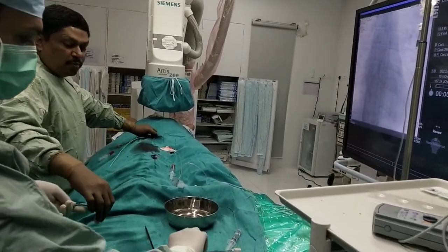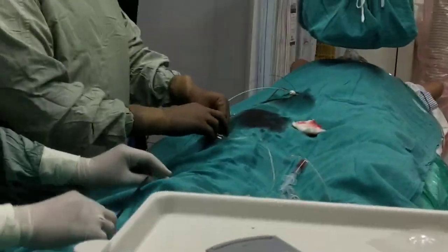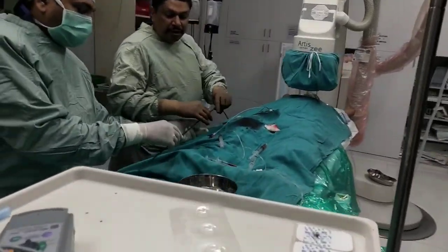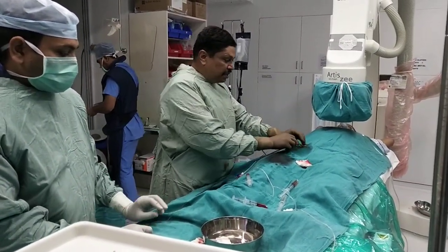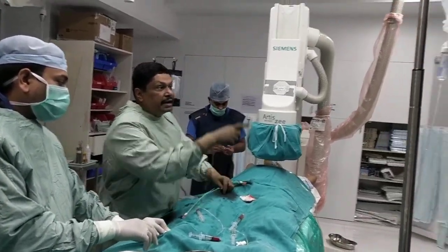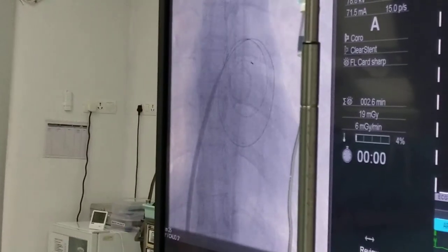We are putting the spring wire inside. Now this is the dilator which we are putting over the spring wire. The purpose of this dilator is to dilate the septum as well as the venous axis. Both are dilated so that the balloon can pass easily. There was fibrous tissue at the venous axis which we have dilated. Now we are dilating the septum with the dilator.